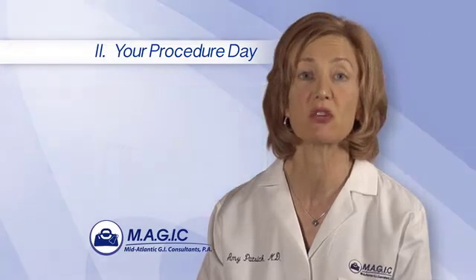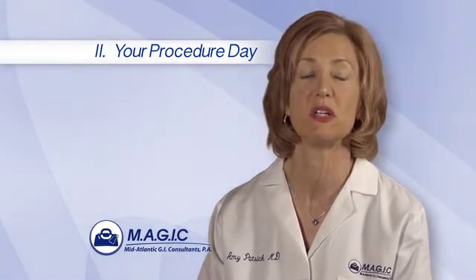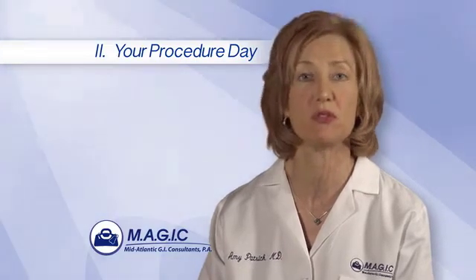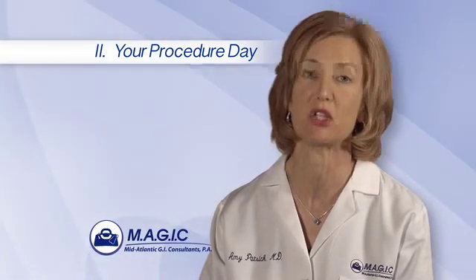During the study, your doctor may need to take a biopsy or remove a polyp or growth so that tissue can be examined under a microscope. Sometimes tissue is removed with a simple forceps instrument, and at other times, electrocautery must be used. The entire procedure usually takes about 30 minutes, but procedure times vary for each patient.